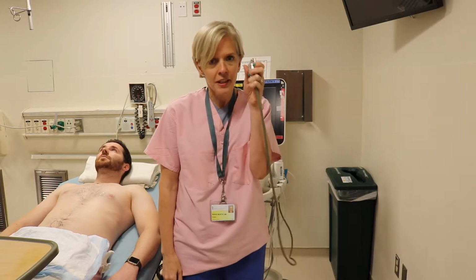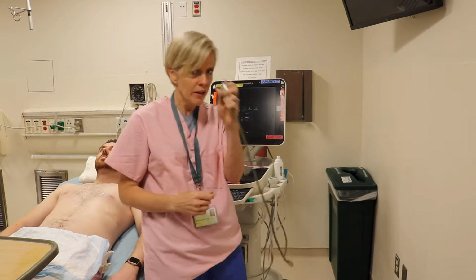Recording. We're going to go over the most important part of any ultrasound exam. It is plugging in the machine and entering in the patient data. So right now we're going to plug in the machine.